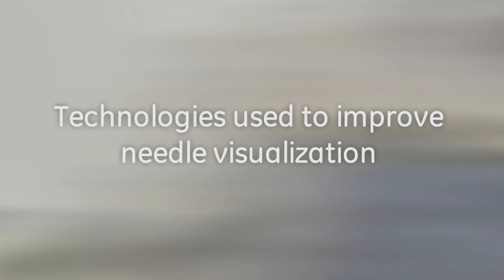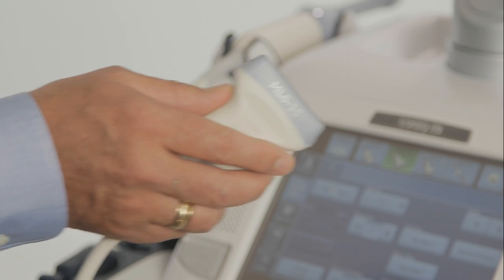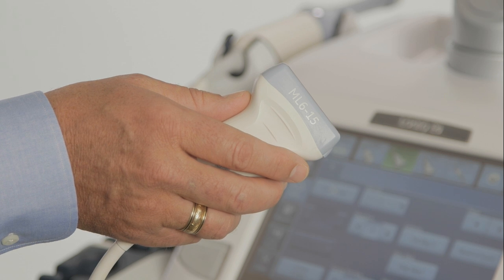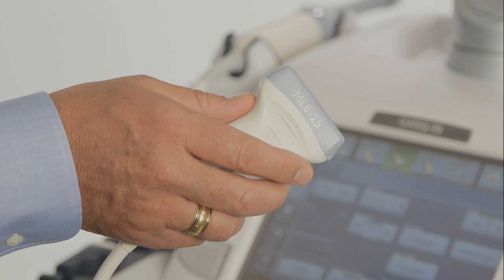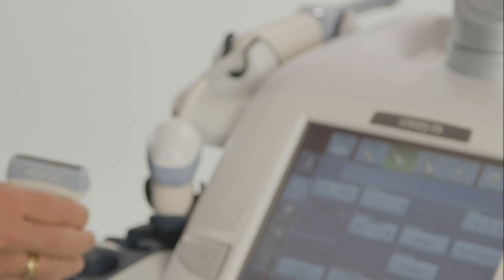Here are some general needle visualization recommendations that can help during an invasive procedure. Use a linear probe if possible. A linear probe will offer better needle visualization compared to a curve or sector probe, especially if the lesion is less than, say, half a centimeter.